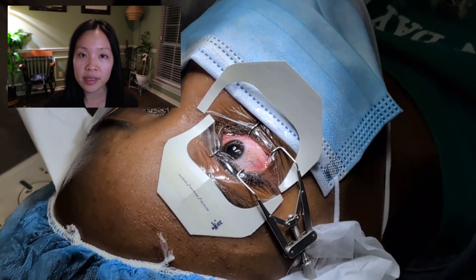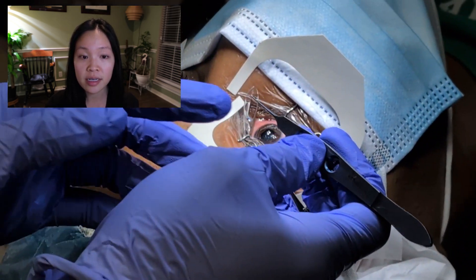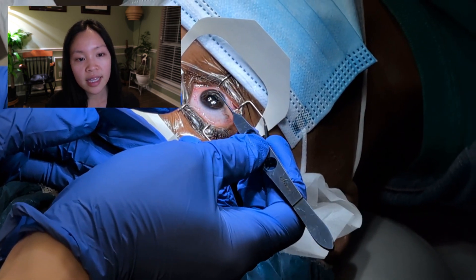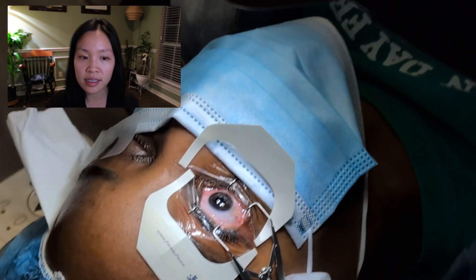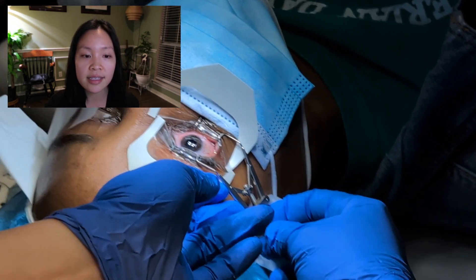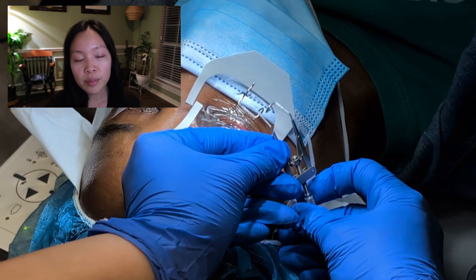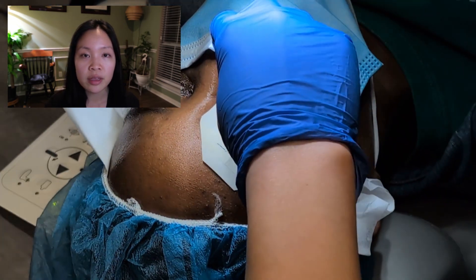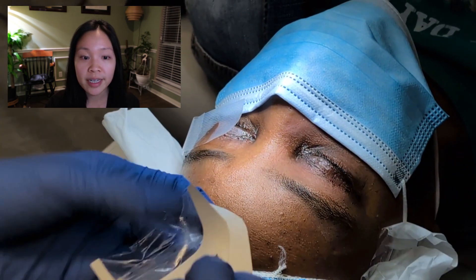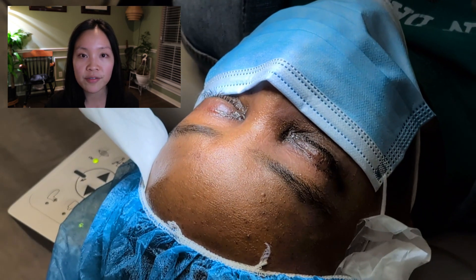Now the corneal epithelial scraping is done, the laser reshaping of the cornea is done, and the post-laser haze-prevention treatment is done. The last step is placing a contact lens — literally just a normal contact lens — that acts as a physical bandage and barrier to help with the patient's comfort and to help those epithelial cells grow smoothly over the surface of the eye as they heal the wound. We then remove the Tegaderms and we're about to start on the left eye.